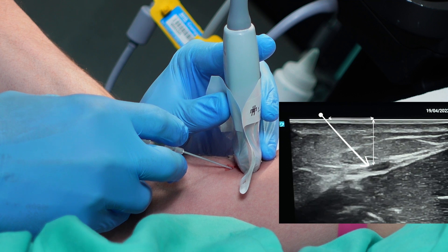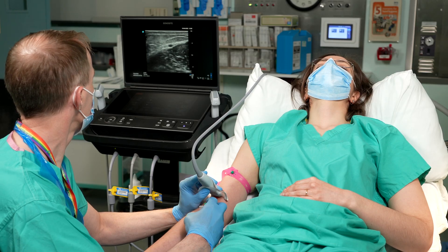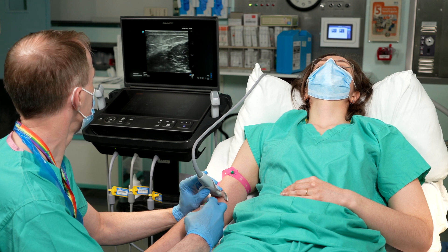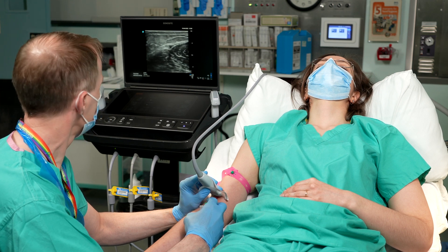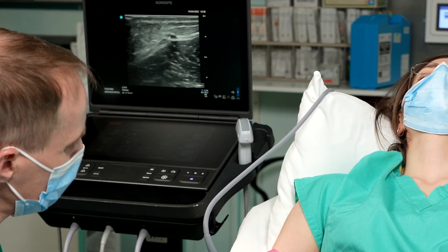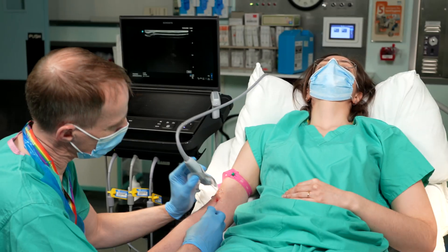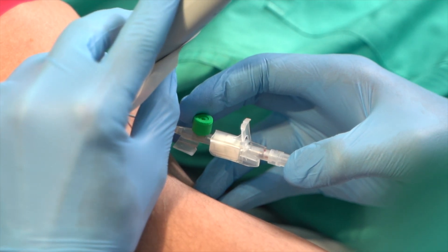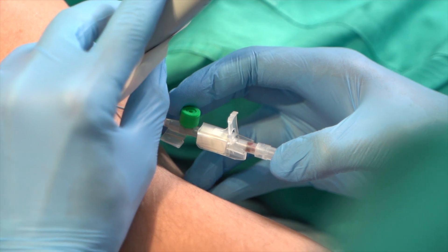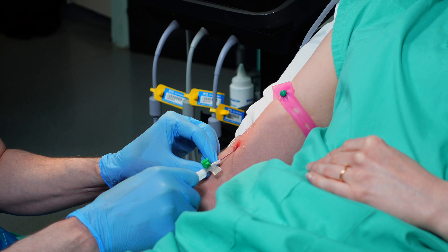In-plane views can be used for troubleshooting vein transection, but it makes it much more likely that you'll miss the vein, as you have a relatively narrow field of vision and it's easy for the needle tip to disappear off the screen. Any circular opaque object appearing on the screen likely represents a cross section of your needle passing under the probe. Once you get flashback into the hub, advance the cannula into the vein as normal, then clean the ultrasound jelly off the skin before applying your dressing.